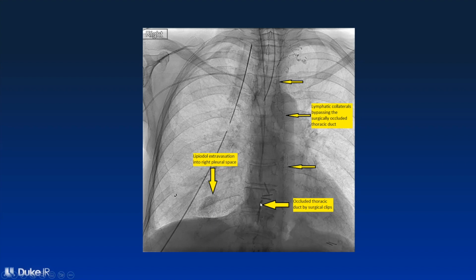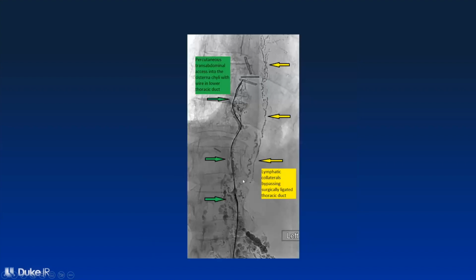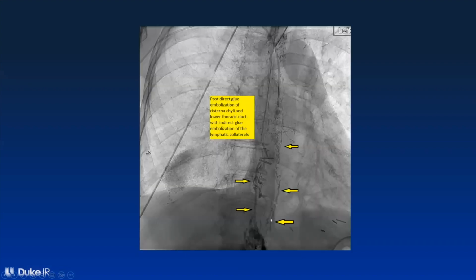And the reason for that is that patients can have lymphatic vessels bypassing the thoracic duct, or can develop them after the surgery. And you can see the leak here, and you can see those extra lymphatic vessels bypassing the surgical clips. You can see that our wire cannot go through the clips because the thoracic duct is effectively clipped by the surgery that the surgeons did, but these vessels are still open. So we glued them with that sterile crazy glue, and the leak stopped.